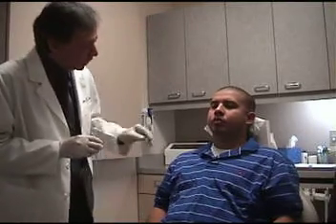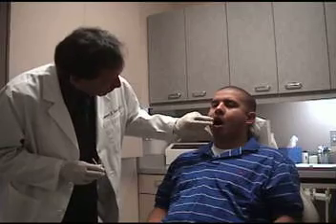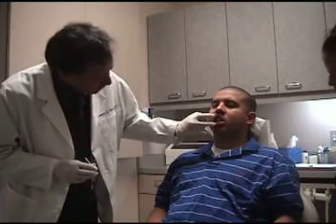So now we're going to match these up to the rest point of the phonetic position. We're going to take a look and ask the person to speak and see how the mandible changes in this movement. Okay, so let's take a look at the habitual occlusion. Can I have you close together, please? Okay, and that's the occlusion.